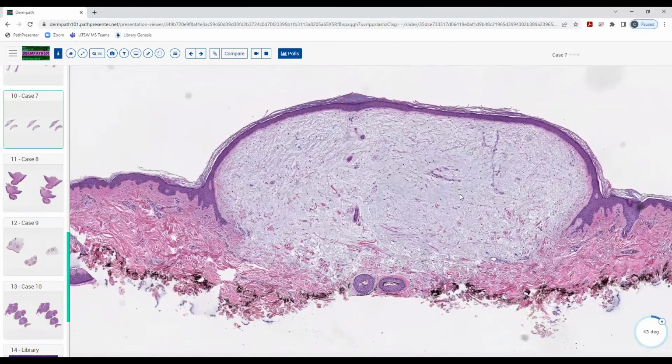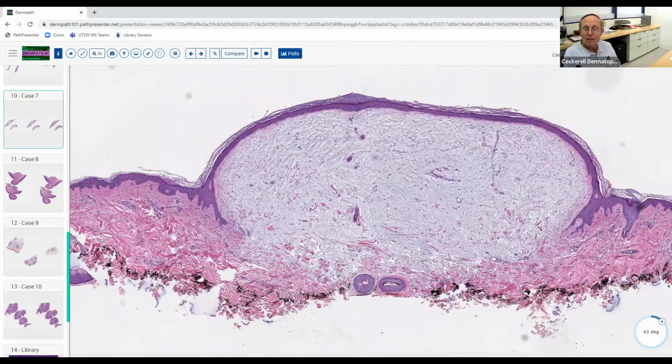I got it down to cutaneous myxoma or a digital mucin. Well, or just focal cutaneous mucinosis. Probably not a digital mucous, quote, cyst, end quote. That's usually seen on volar skin. This looks like there's part of a hair follicle here and a sweat gland over here. So this is probably just a little focal cutaneous mucinosis or cutaneous myxoma. Usually these are just coincidental. They don't really mean anything. They're not associated with any diseases most of the time.